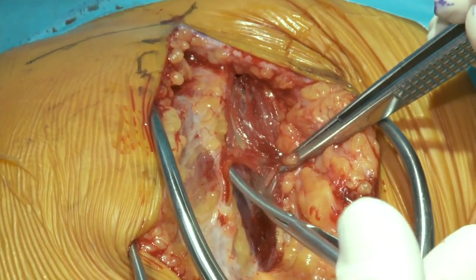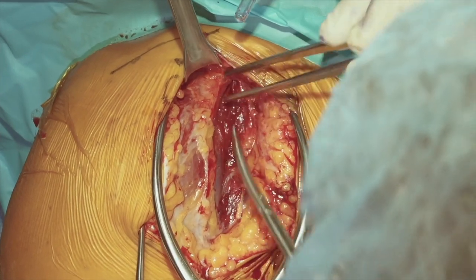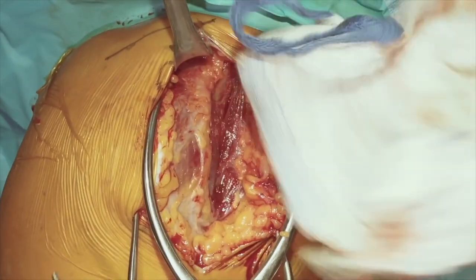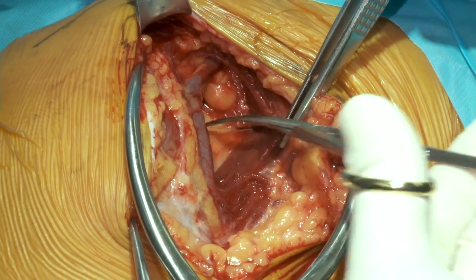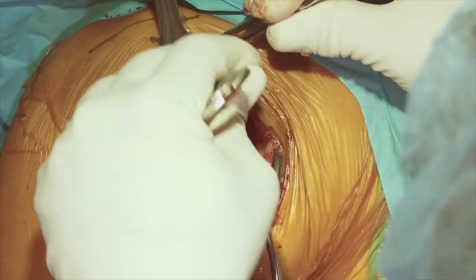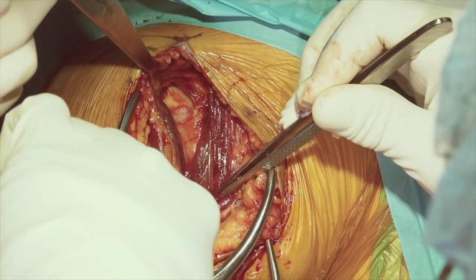We'll proceed more proximally, keeping a close eye on the vein and trying to protect it from injury. As we get more proximal, we'll try to identify the separation between the deltoid and the pectoralis major, which will give us the plane where our coracoid process is located. Once we lift off the deltoid from the pectoralis and know exactly where the coracoid is, we can take our pointed Hohmann retractor and slide it underneath the deltoid, over the top of the coracoid and the coracoacromial ligament, giving us excellent lateral retraction to continue developing this plane.